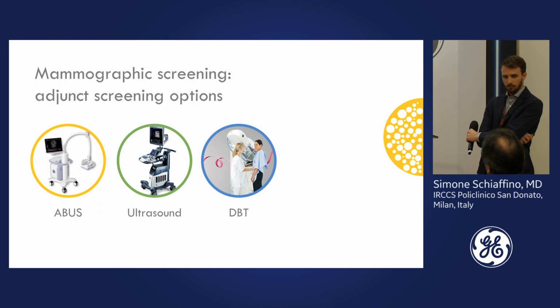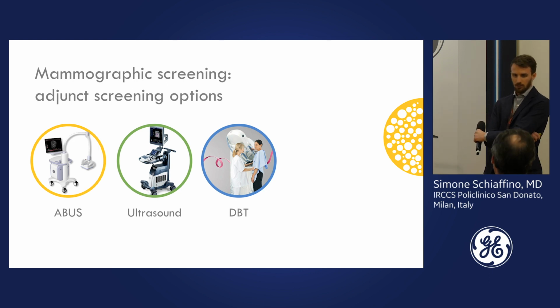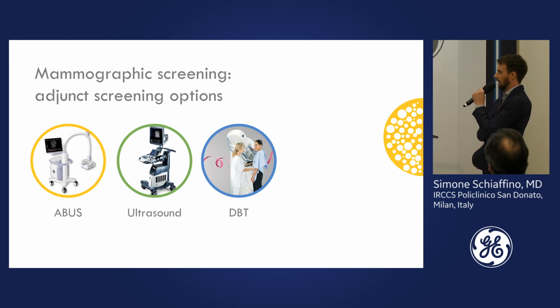But I use the ABUS in younger patients and also in asymptomatic women. So without symptoms? Without symptoms. If you have symptoms, you perform ultrasound? The ultrasound. Yes, I agree with you. Okay, other opinions? Do you agree all? Yes, okay, let's move on.